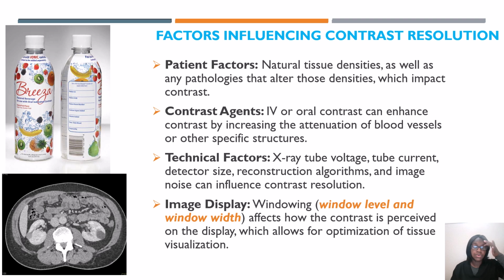So, for example, if you are looking at an abdomen or a chest, and you can't see the organs and the body tissue well, you're taking your mouse and your cursor and you're holding down one button and moving your mouse on your desk to get a better picture. So that's window and leveling, whenever you're dragging that cursor around the image to try to see, should I make this brighter? Should I make this darker? Can I see this better?